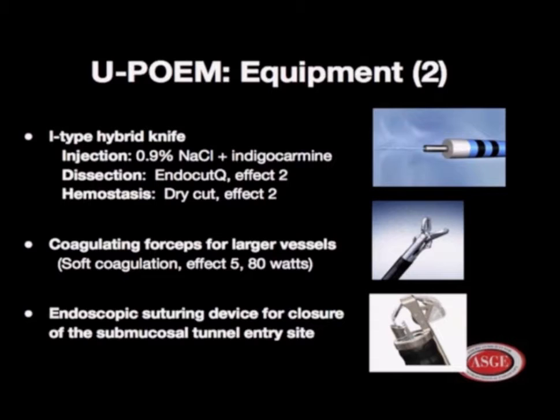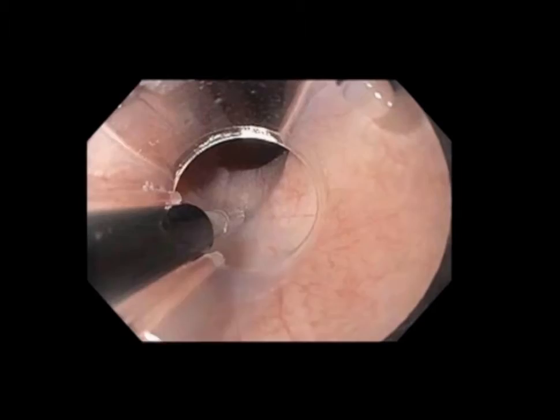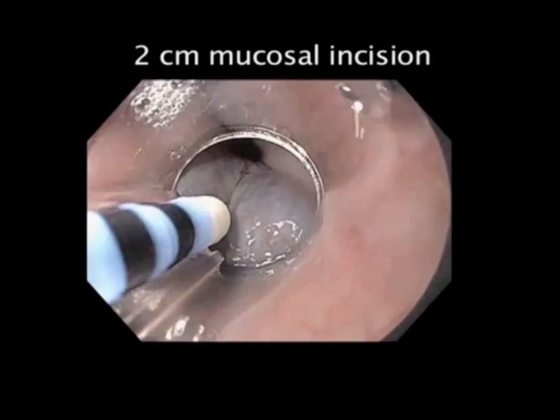We start 12 centimeters above the GE junction with a posterior injection. Using the standard injector needle, we inject a mixture of saline and indigo carmine to create a submucosal bleb. We then switch out for the hybrid knife and make a 2-centimeter longitudinal incision for entry into the tunnel.